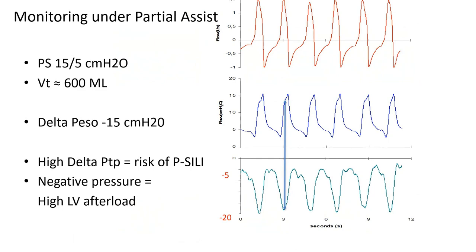The last indication, and I could spend a lot of time on that, but we are a bit short, so I will describe it very briefly, is to use it during the most frequent situation in the ICU. It's when the patient is breathing spontaneously but assisted by the ventilator. And why is it important? Because this is the part of the pressure you don't see on the ventilator, which is also distending the lung. To make it in a simple way, this is a patient on pressure support. We are delivering like 15 of pressure support, so you would say 15 is really not that high. But this is the esophageal pressure swing the patient is doing. He's doing minus 15. So the total pressure distending the lung is 15 plus the other 15, or minus 15 if you wish. So this patient ventilated with 15 of pressure is not protected.